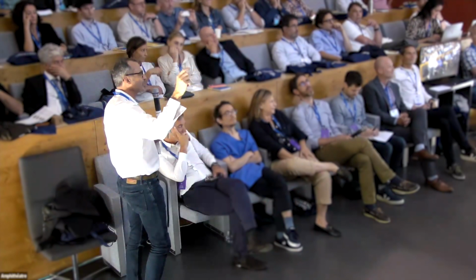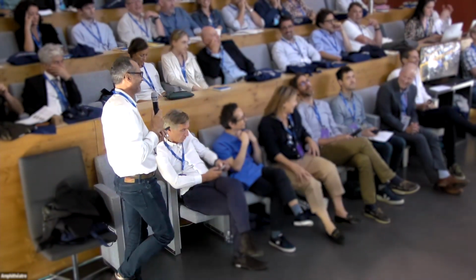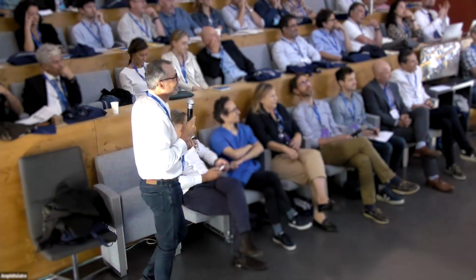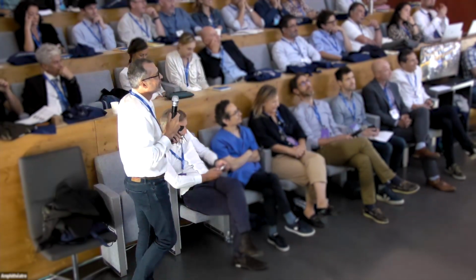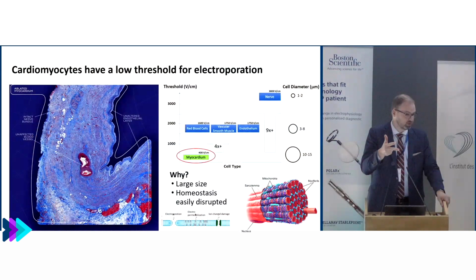Well, the first reason it's still there is it's the easiest thing to talk about. The second reason is, like I was just mentioning, it's not a perfect number. It depends on your catheter, it depends on your waveform, it depends on your polarity.